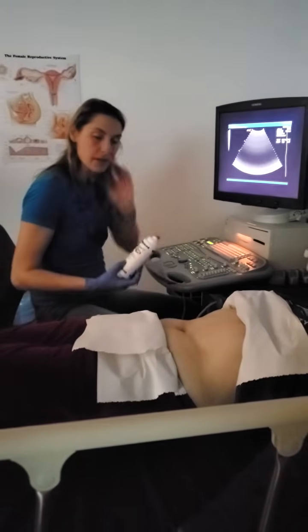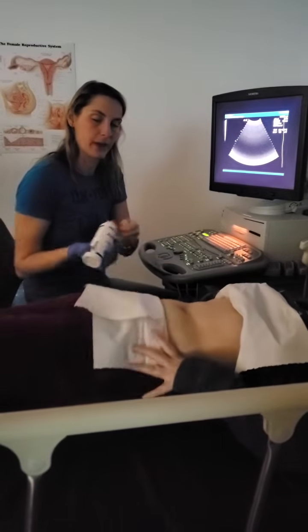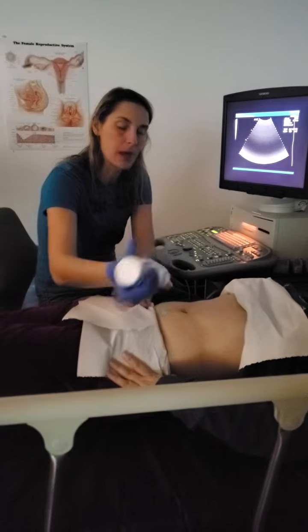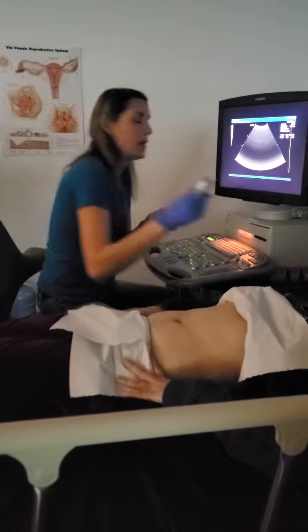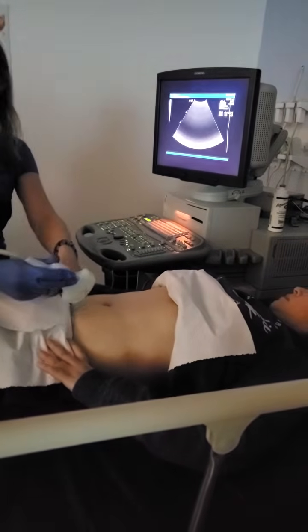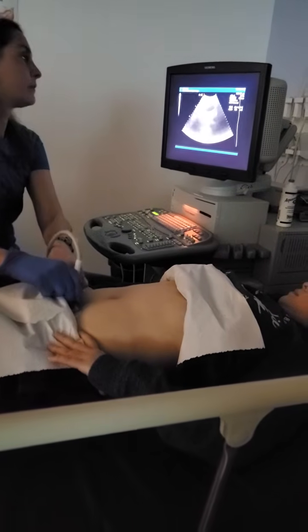All right. So I'm going to have you move your pencil just a little bit more. You're going to be in your neighborhood here. Oftentimes when you have these patients, you have to do either pelvics on them or bladders. You have to get a little bit lower than you think. And so you don't want to perv your patients out. So what I'll usually end up doing is kind of putting my hand under the waistband and then lifting it up so I can get to where I need to go.